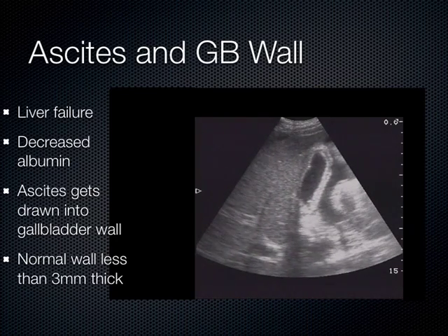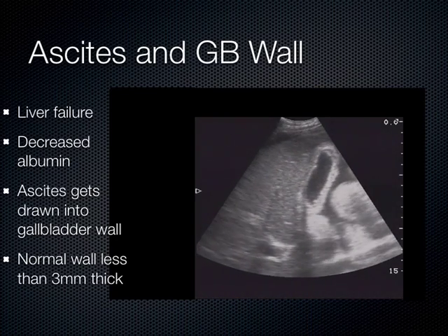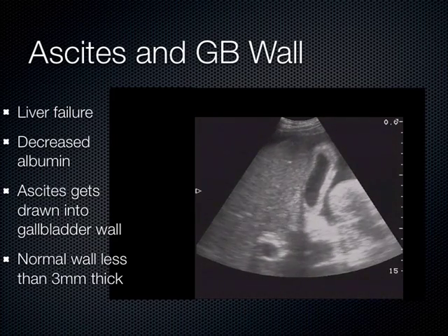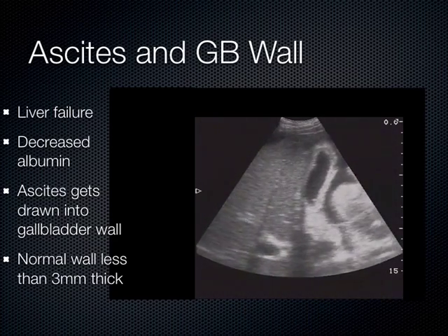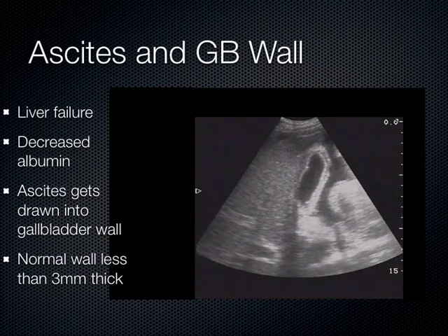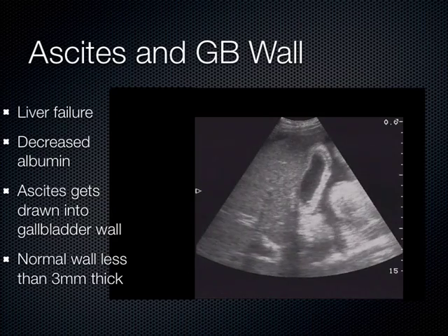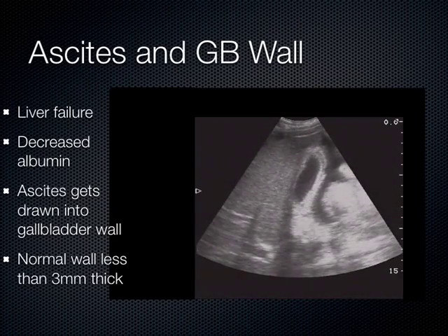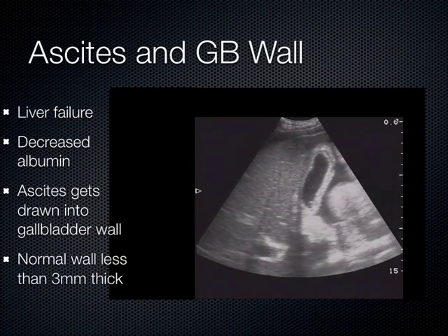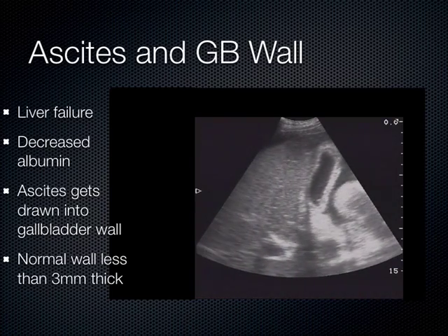So what happens is the gallbladder contracts down and the wall itself appears falsely thickened, which is why if I'm really curious about a patient's gallbladder wall, I want to measure it, I try to do it if they haven't eaten for at least 4 or 5 hours. That's the reason why we do that sometimes. So it depends what the models had for lunch. Most of the time, it's almost impossible to eat zero fat. So usually their gallbladders are a little contracted, making them a little bit hard to find.